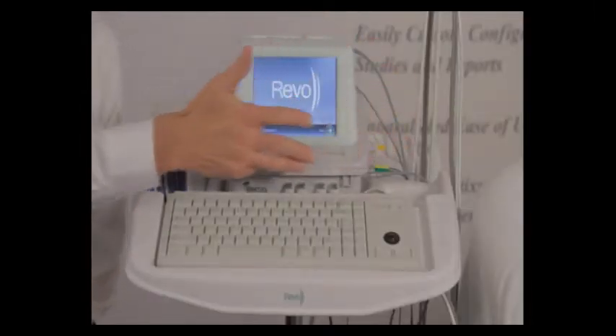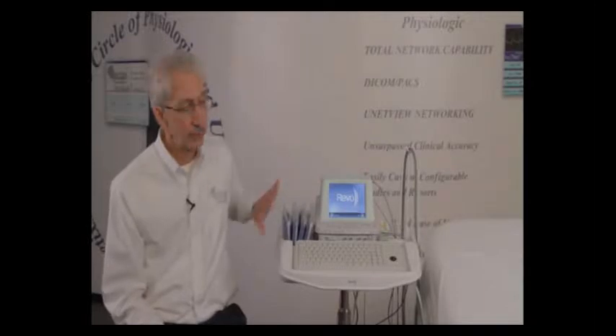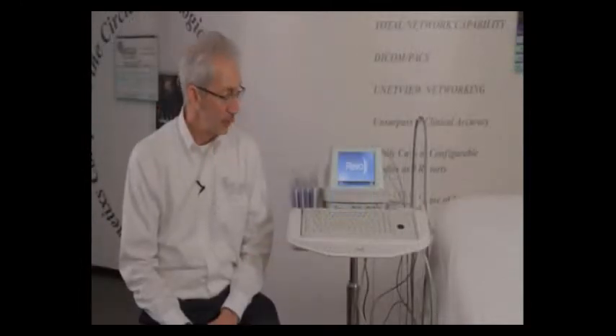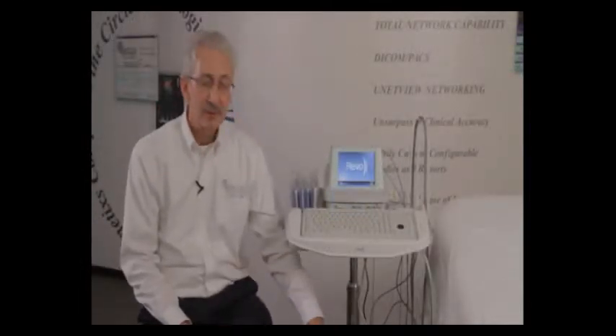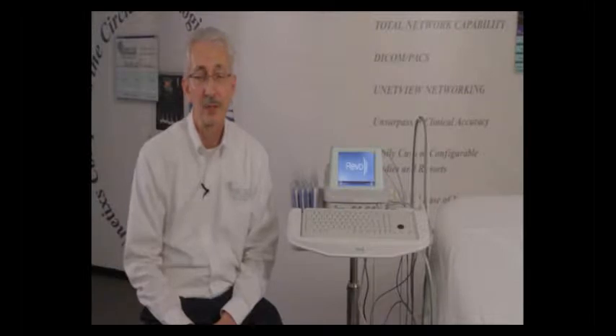The REVO 1100 is shown on its optional cart, which gives you a place to store your cuffs and accessories out of harm's way. The REVO also features an adjustable cart that, depending on user height, can be raised or lowered. The unit also has an option for an uninterrupted power supply if you're going to be moving it from room to room — you can move it without having to shut Windows down and wait for it to boot back up.